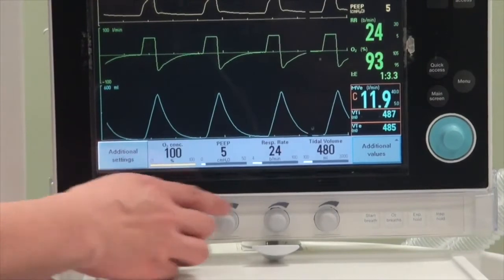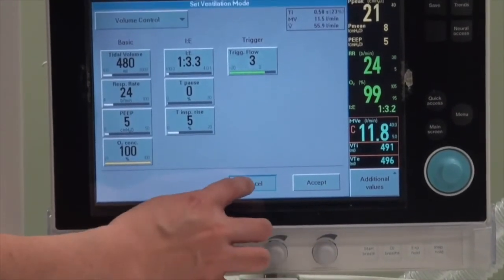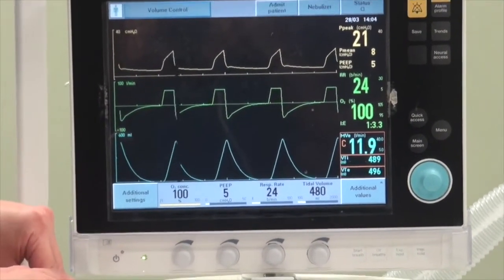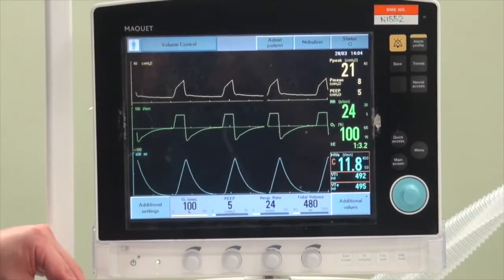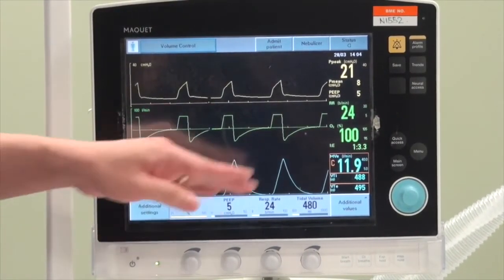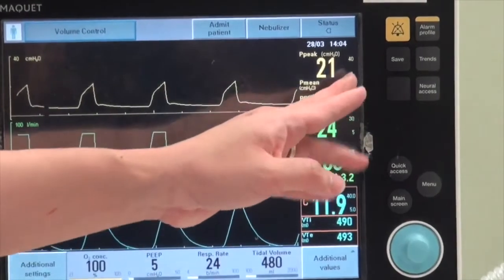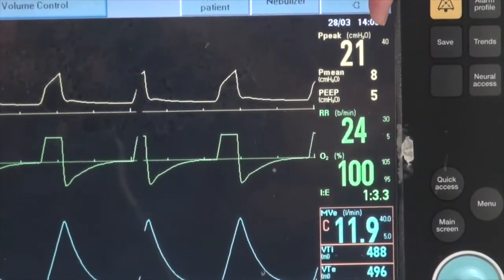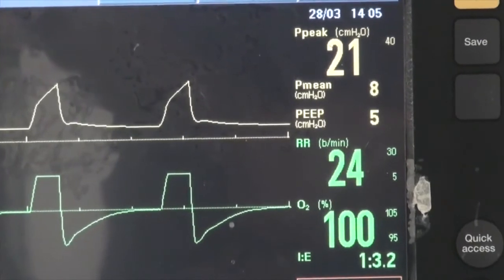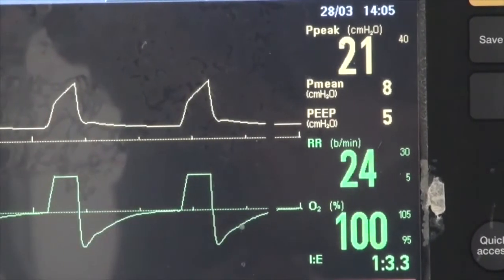Alternatively, you can press down on the main control and adjust settings through the main menu. On the right-hand side of the screen, there is a column of measured parameters detected from the patient, color-coded by category. In yellow are the pressures — the ventilator shows peak airway pressure, mean airway pressure, and PEEP. The smaller numbers in the corner indicate the upper and lower alarm limits for each parameter.